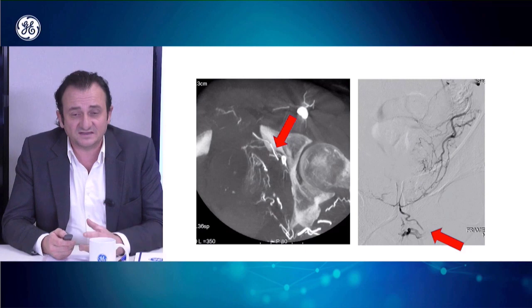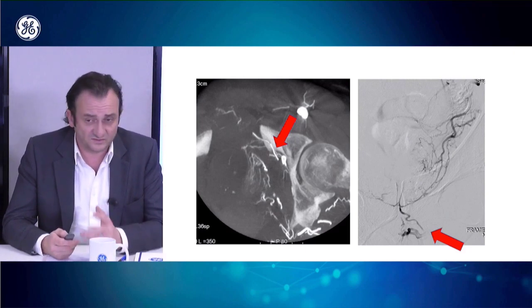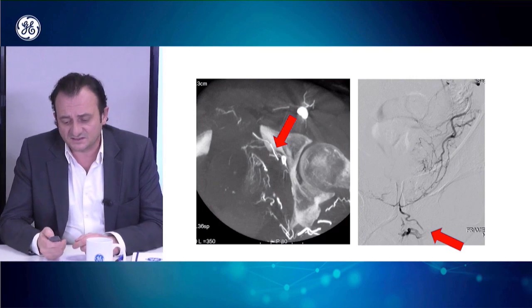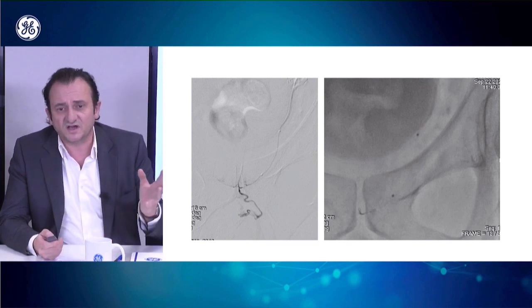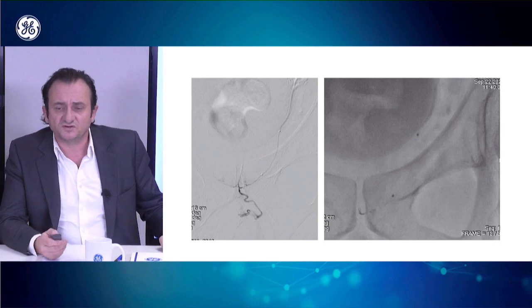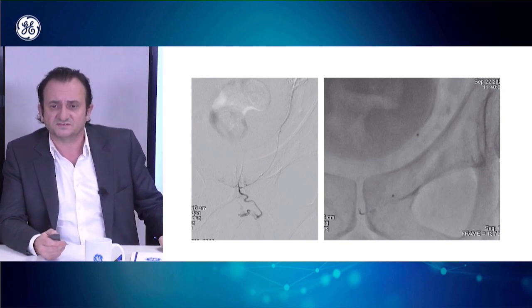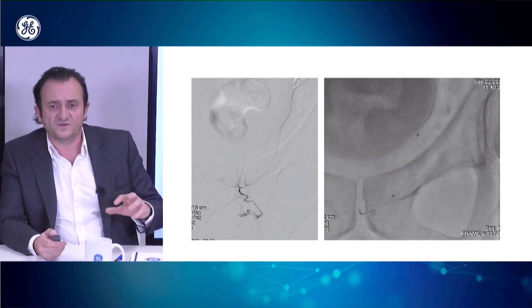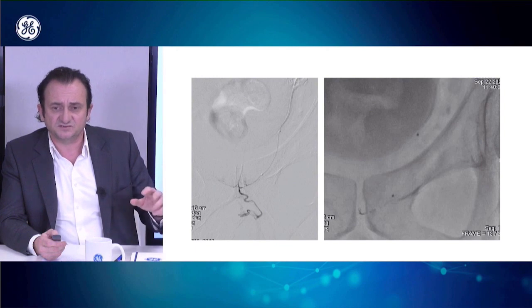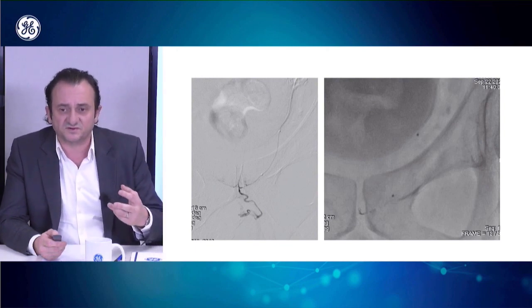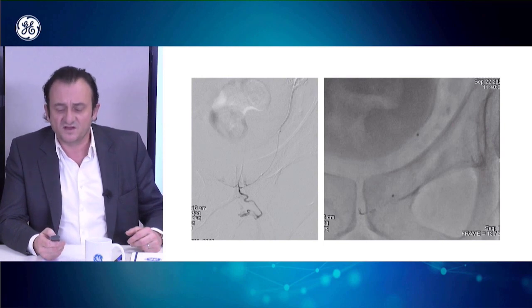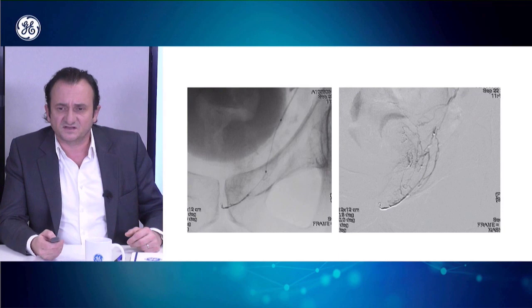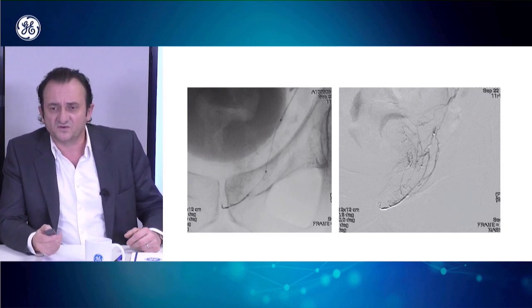You can see the catheterization of the pudendal with a pudendal accessory artery which goes directly to the prostatic artery. You cannot inject spheres from here because they would go directly into the pudendal artery. The goal is to come as close as possible to the distal part of the anastomosis and occlude it, usually with very small coils of 2.5 millimeters. The embolization of the anastomosis has been done and now I can embolize the rest of the parenchyma.